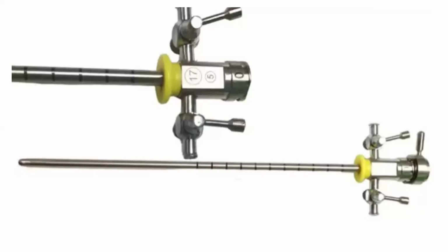It can admit any instrument, sir, but the maximum size it can admit is only 5 French. Only 5 French will be the maximum which it will accommodate. Yes, sir. And it is usually made up of stainless steel alloys.